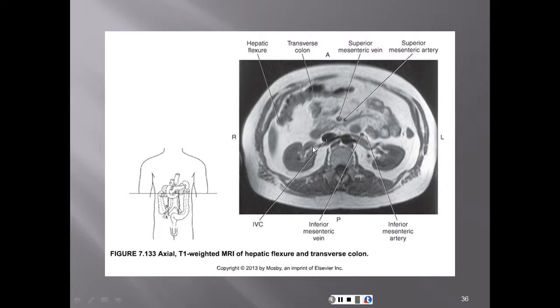You can even see the renal artery that stretches and goes posterior to the IVC and enters into the aorta. You can see the left renal artery extending off of the aorta. The renal vein courses anterior to the aorta and enters into the inferior vena cava.